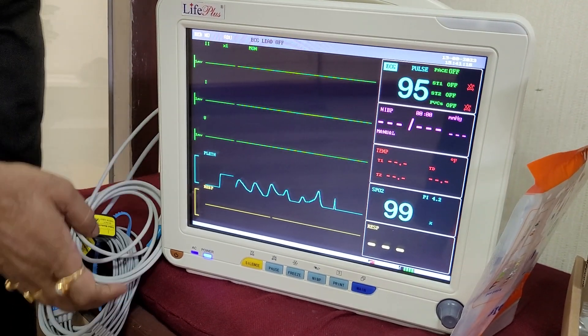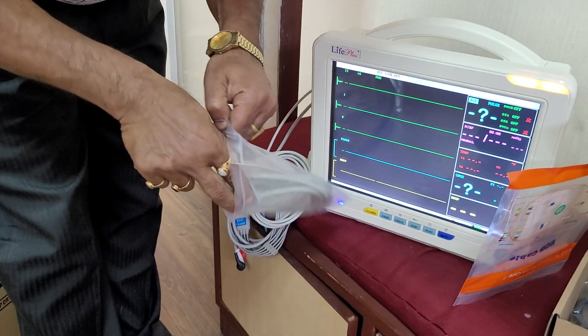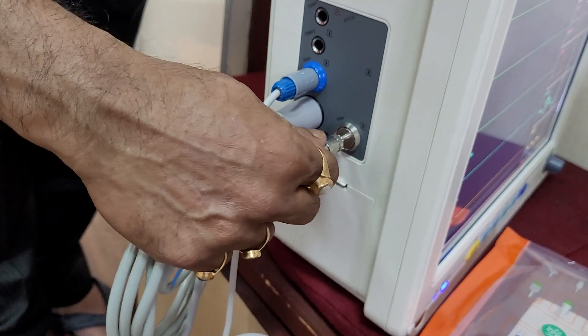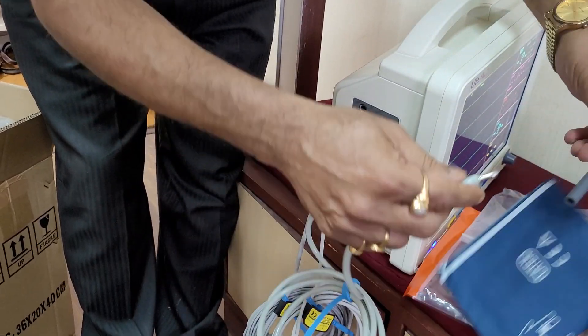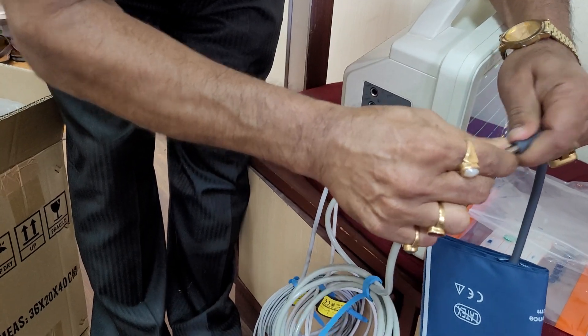Another thing is that we have this NIBP cable. This is the NIBP tube, which is connected in that point. This part is connected on the NIBP tube — gentle push. This is connected.